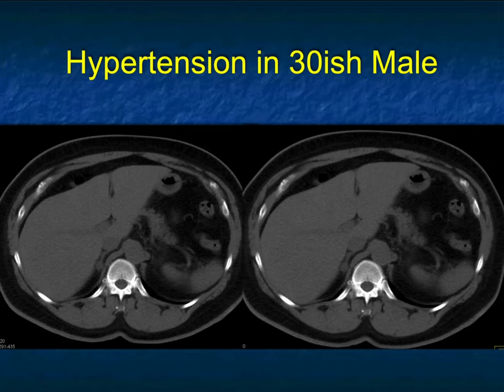Now, I mentioned this talk is only going to be about 4 centimeter masses, but let me break my rule and show you 2 cases. And these cases to me are kind of a warning, and I like to show them because it also makes the point about following rules.